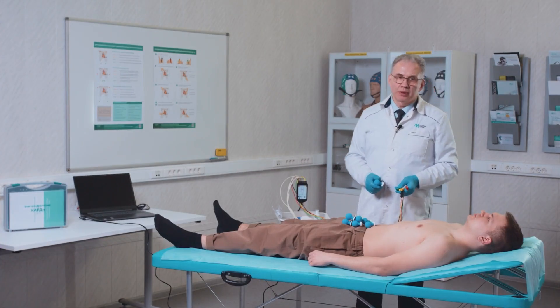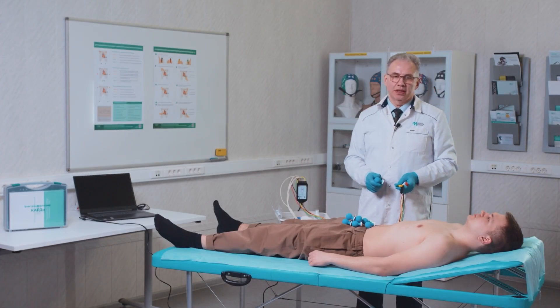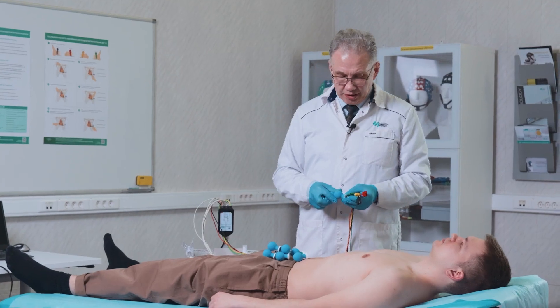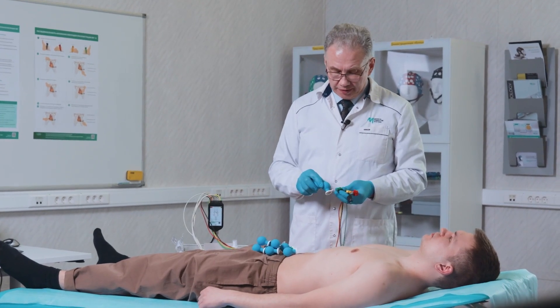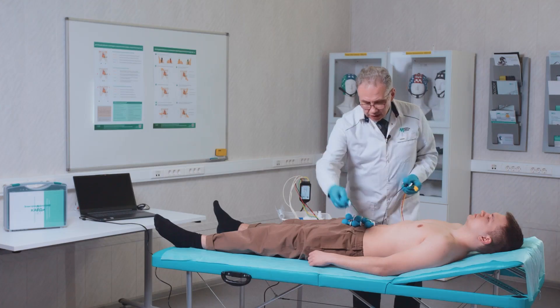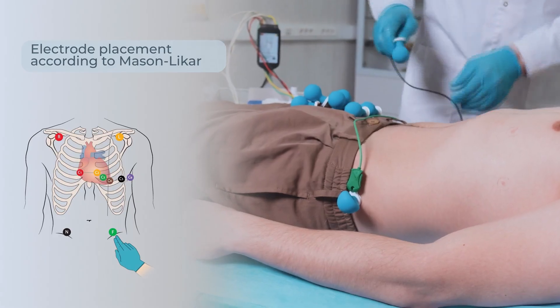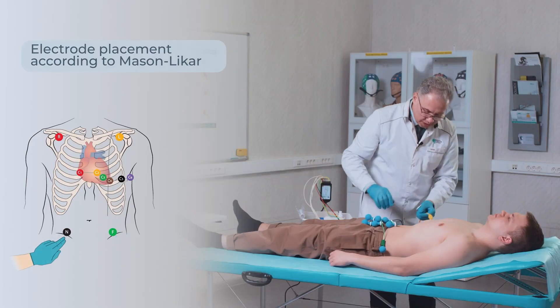For proximal dislocation of electrodes, when using reusable electrodes, it is most convenient to use the same chest suction cups as for all the others. We place them according to the Mason-Likar scheme above the iliac crest.